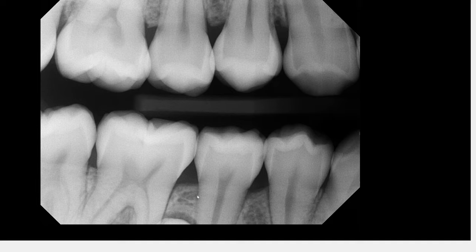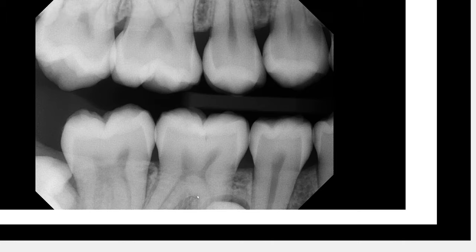Now let's take a look at the molar bitewing of the same area. You can actually see that unknown lesion a little bit better here. There's that opacity which appears to superimpose with the mesial root of number 30, and then the radiolucent rim. Additionally, on this radiograph you can also see the crown of third molar number 32.